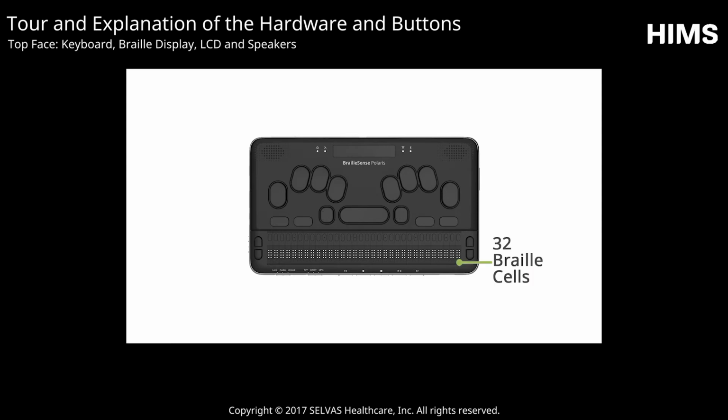Below the Braille keyboard is a 32-cell Braille display with 32 cursor routers above it. On each 5th cursor router is a very prominent dot to make orientation easier. Between the actual Braille cells and the cursor routers is another new addition. We have a touch strip that allows you to perform touch gestures similar to what you might use in VoiceOver or TalkBack.